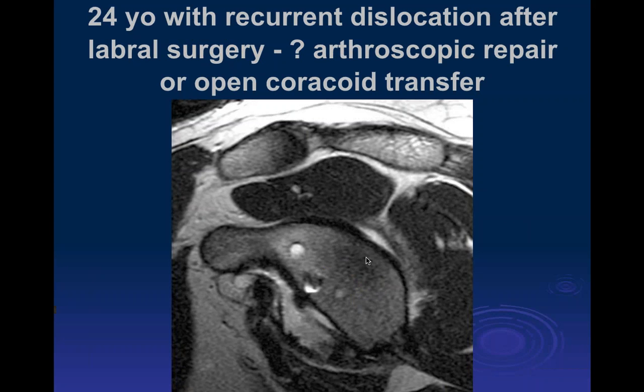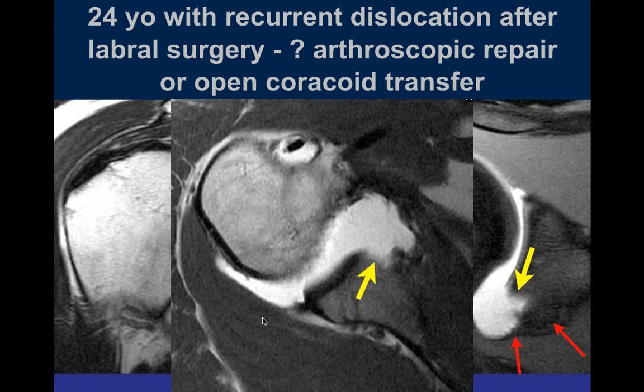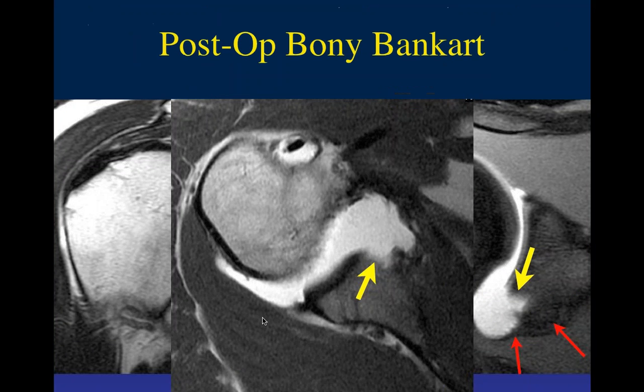If we go back here, you can actually see that this is a bone that's been displaced out here. So this is a recurrent injury, and now it's a bony Bankart injury, requiring repair. John, do you have any comments about this?